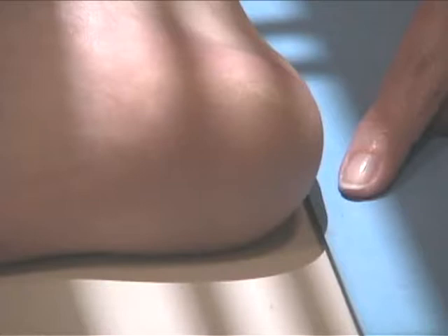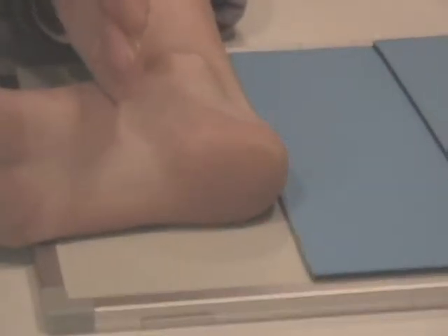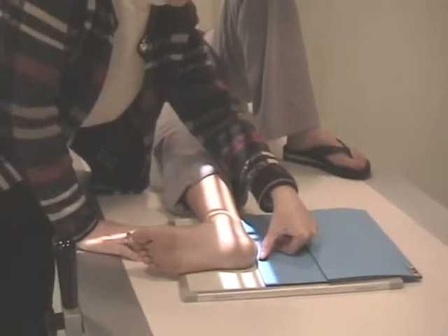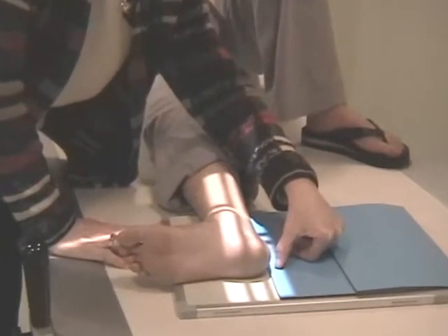That might be necessary with a bigger ankle. If you use too much space for the other ones, you came with a certain amount of space for the lateral. If you're going to clip the navicular, you might gain some space on this side by sacrificing a little tissue of the os calcis. This would be acceptable. Okay?